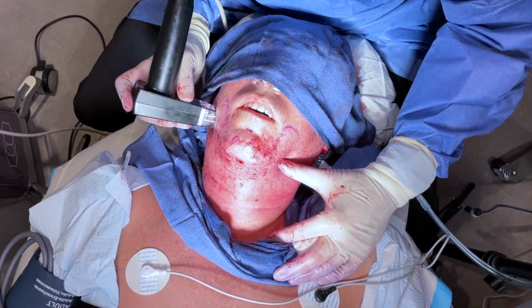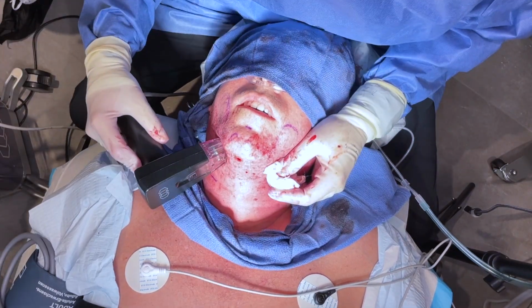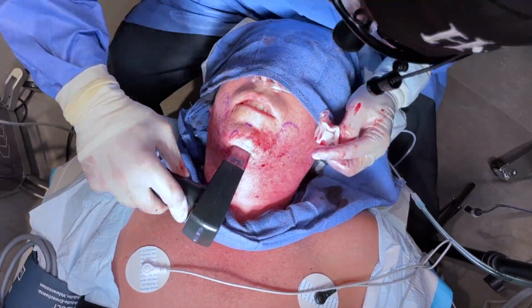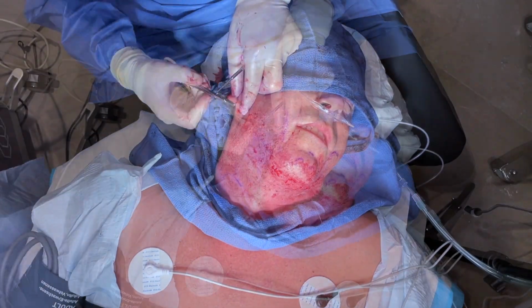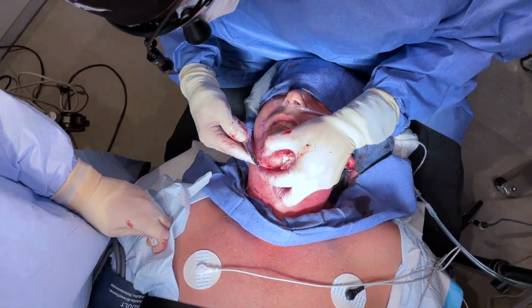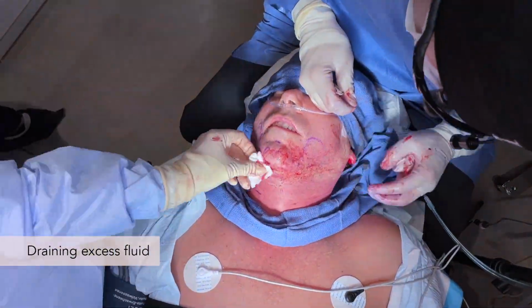Some of the areas where we can afford to melt fat, such as the submental area, we might even go up to 4. It's important to understand that this device can melt fat, and you definitely have to be careful in treating certain parts of the face to avoid chance of atrophy. Finally, we are suturing closed our port sites. Here you can see me massaging all the fluid to one side in order to make sure it's all drained. We've reached the end of the case.